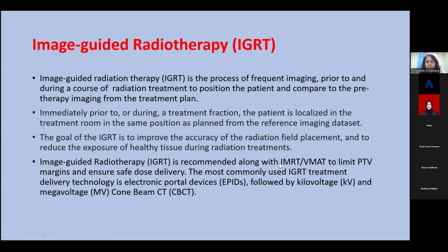It is recommended along with IMRT and VMAT to limit the dose to the surrounding tissues and ensure safe delivery. The most commonly used IGRT treatment involves electronic portal devices followed by kV and MV cone beam CT.